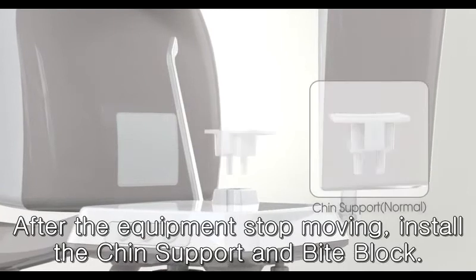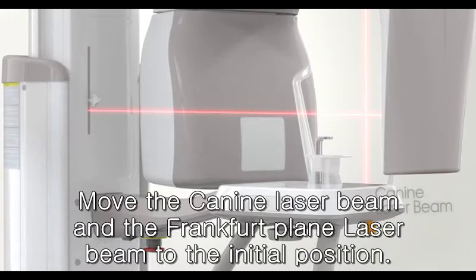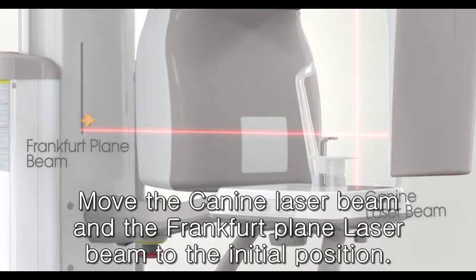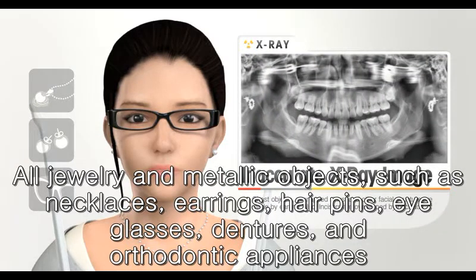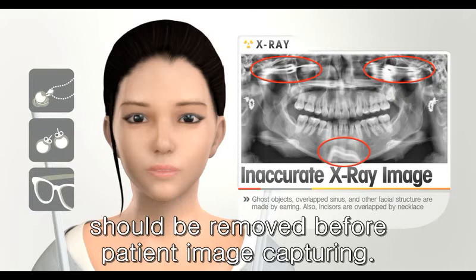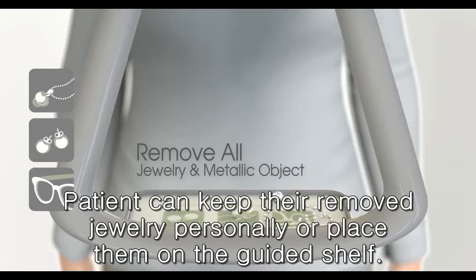After the equipment stops moving, install the chin support and bite block. Move the canine laser beam and the Frankfurt plane laser beam to the initial position. Guide a patient to the unit. All jewelry and metallic objects such as necklaces, earrings, hairpins, eyeglasses, dentures, and orthodontic appliances should be removed before patient image capturing. Patient can keep their removed jewelry personally or place them on the guided shelf.